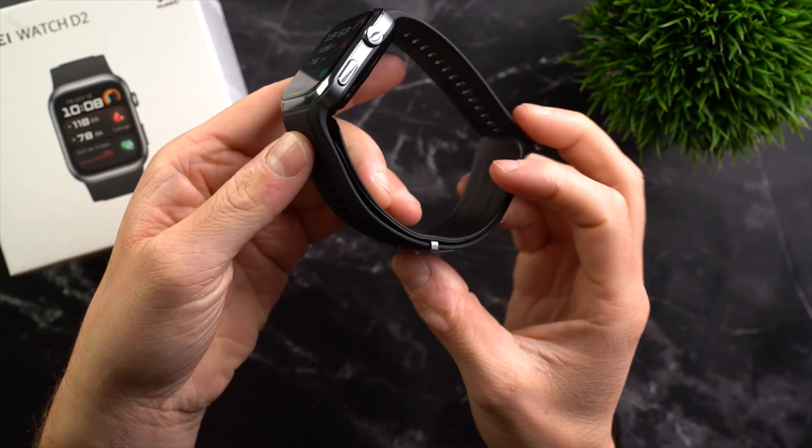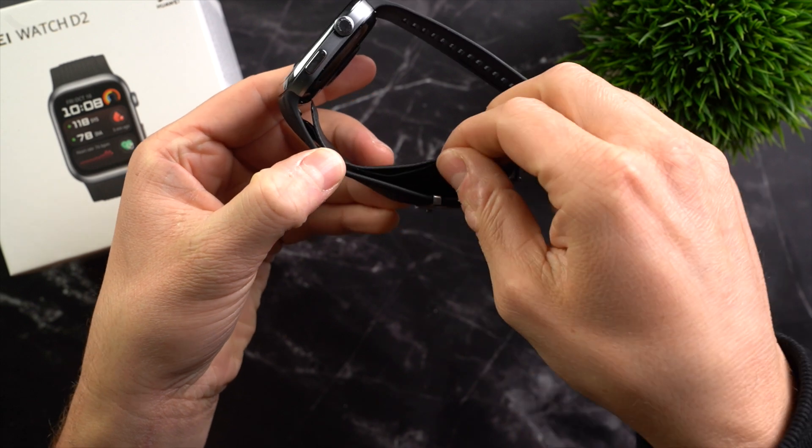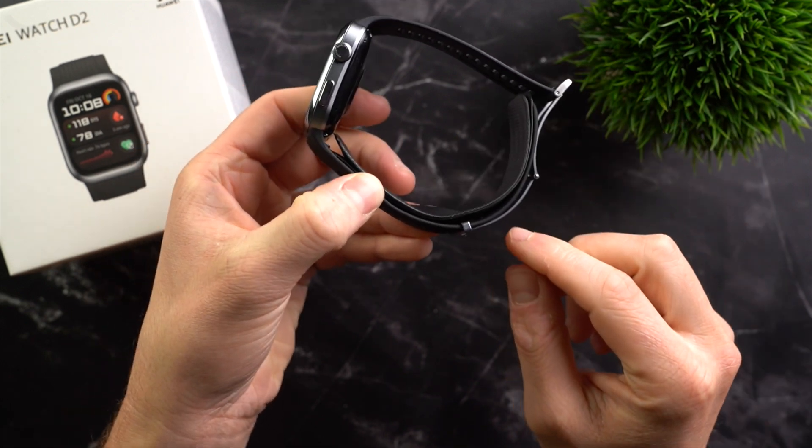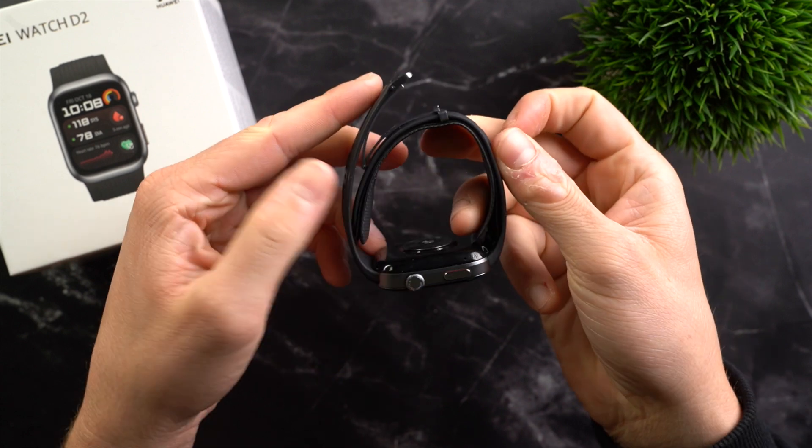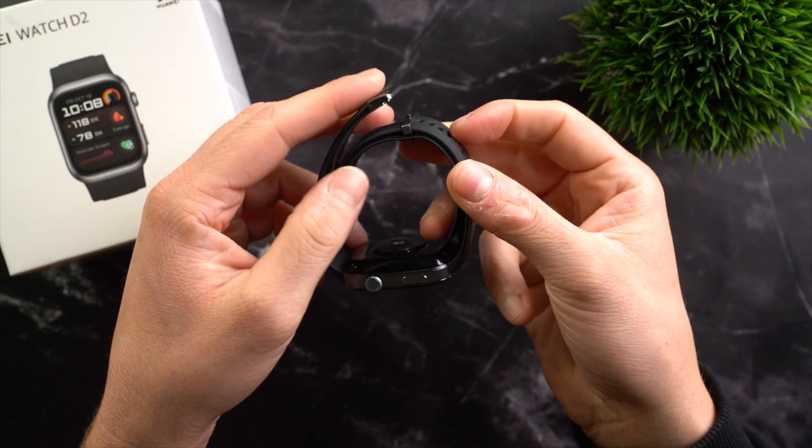For people who need or want to monitor their blood pressure regularly, the Huawei Watch D2 is certainly a great choice. However, you should be aware that it differs from other smartwatches, especially in terms of build and comfort. The strap is thicker because it contains the air cushion, and for the blood pressure measurement to function properly, the strap also has a different fastening mechanism, which makes it less comfortable on the wrist compared to other bands.